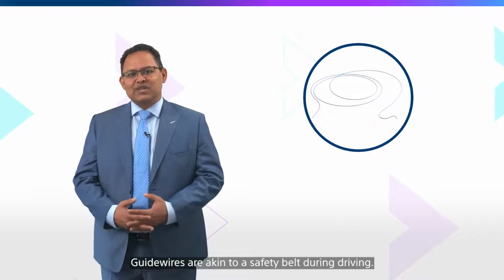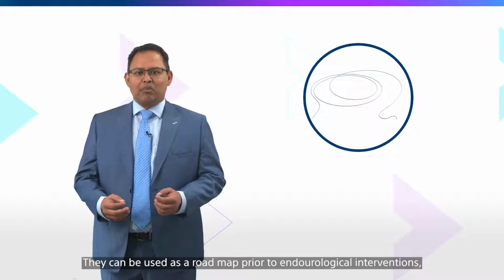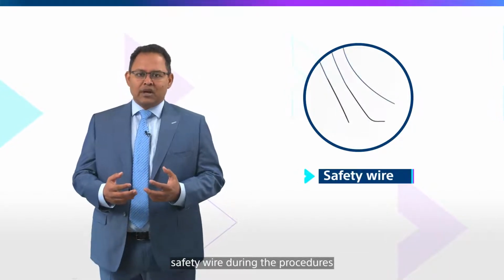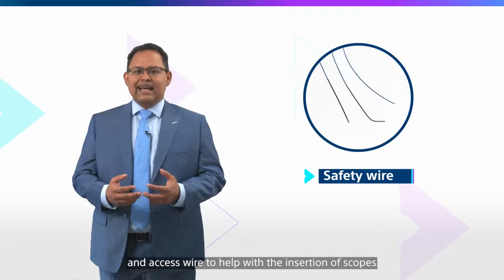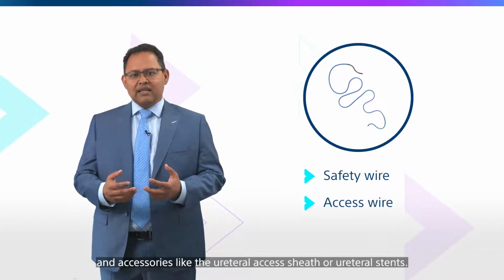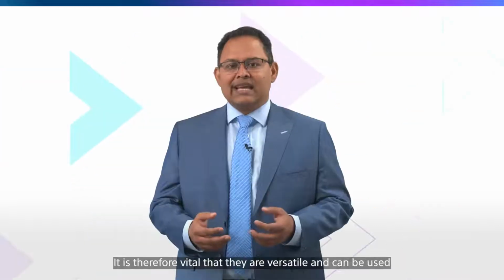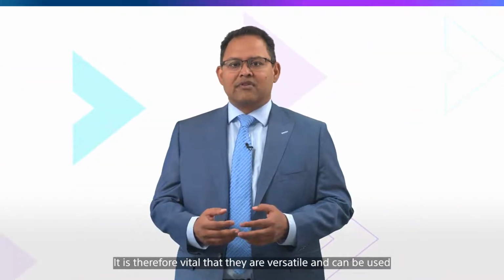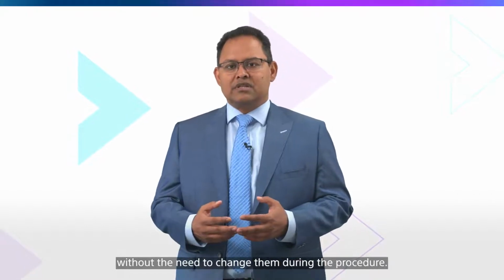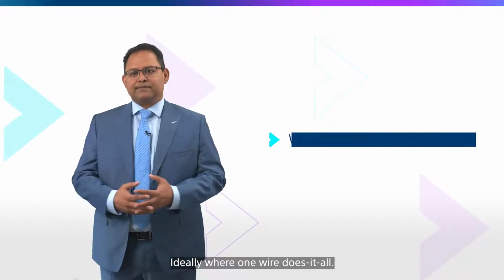Guide wires are akin to a safety belt during driving. They can be used as a road map prior to endourological interventions, a safety wire during the procedures, and an access wire to help with the insertion of scopes and accessories like the ureteral access sheath or ureteral stents. It is therefore vital that they are versatile and can be used without the need to change them during the procedure, ideally where one wire does it all.